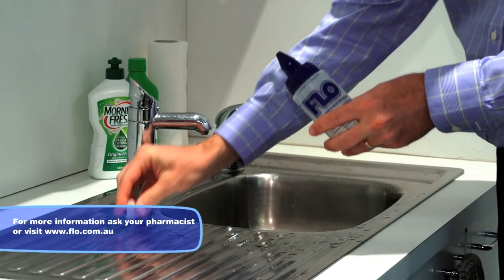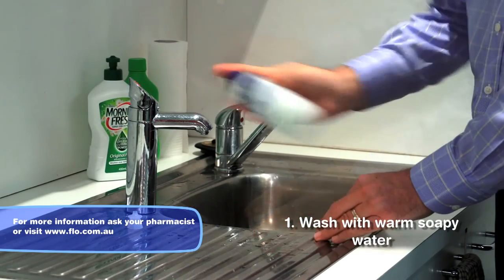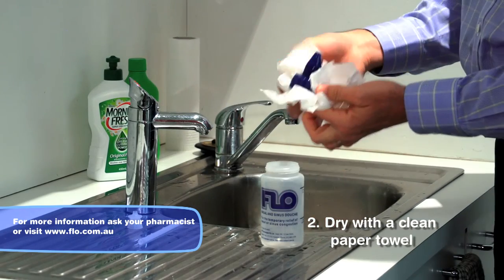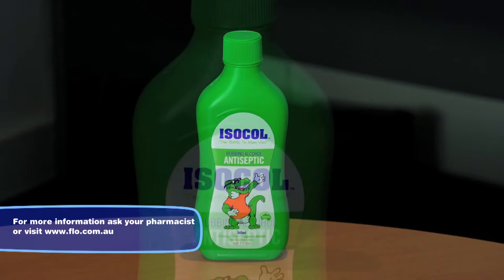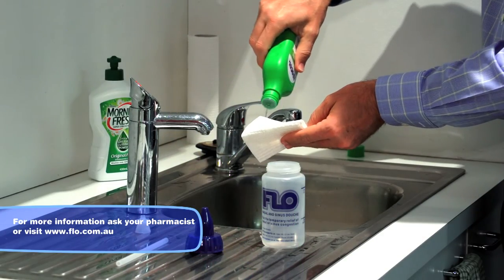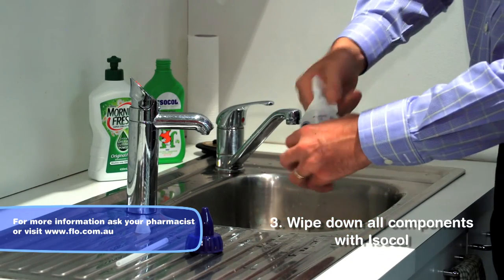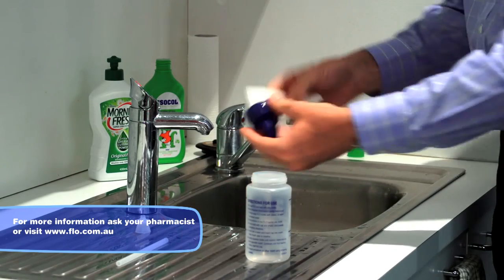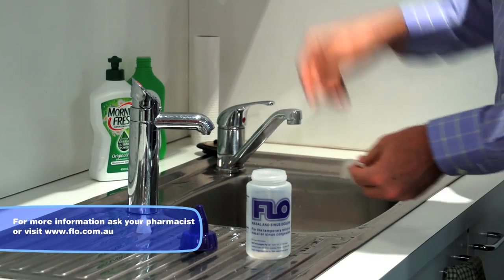When the wash has been completed, you'll need to dismantle the bottle and wash it in warm soapy water. Rinse well and dry thoroughly with a clean paper towel. Next, obtain some isopropyl alcohol or Isocol — it's available from your local pharmacy. Apply the Isocol to a clean paper towel and wipe down all the components of the bottle, ensuring that you wipe down all the threads on the outside of the bottle, inside the cap, and also the dip tube.